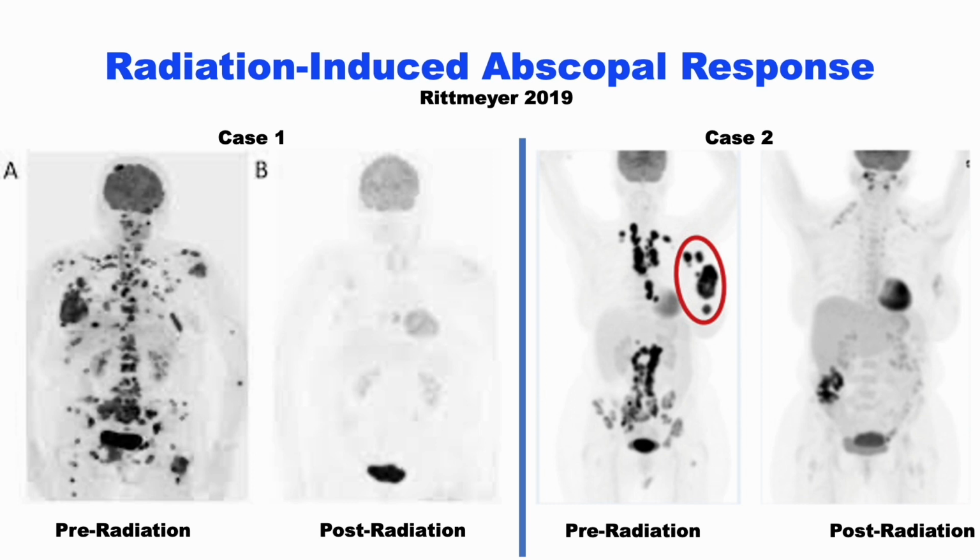But looking at the region of the lung or liver or abdomen, you see in the second image that there's virtually no uptake. In the second image, there is some activity in the abdomen, but that's within the colon, and it also is considered to be normal. But the liver looks normal, the chest looks normal, and the pelvis otherwise looks normal.